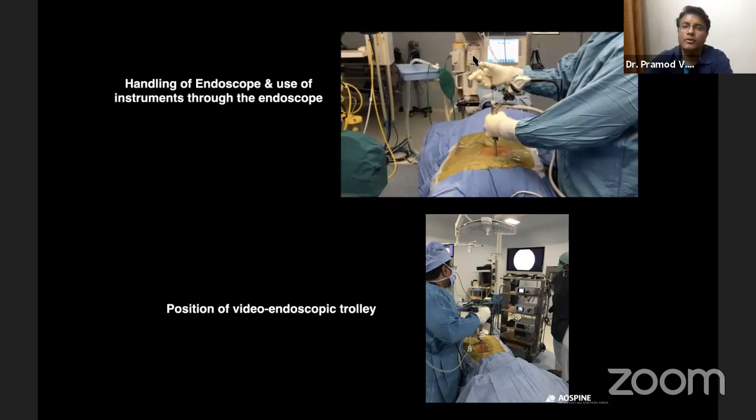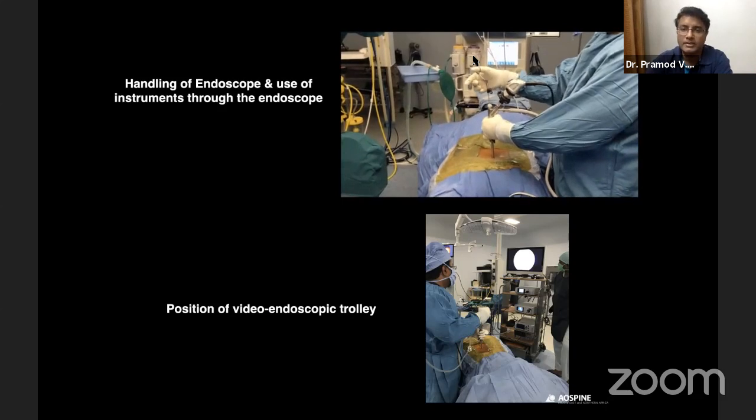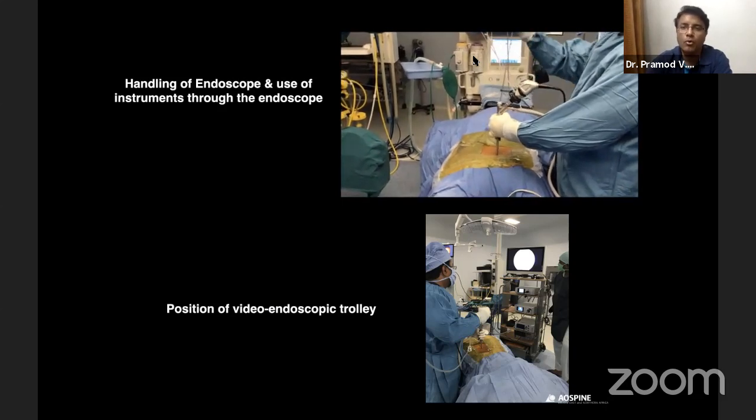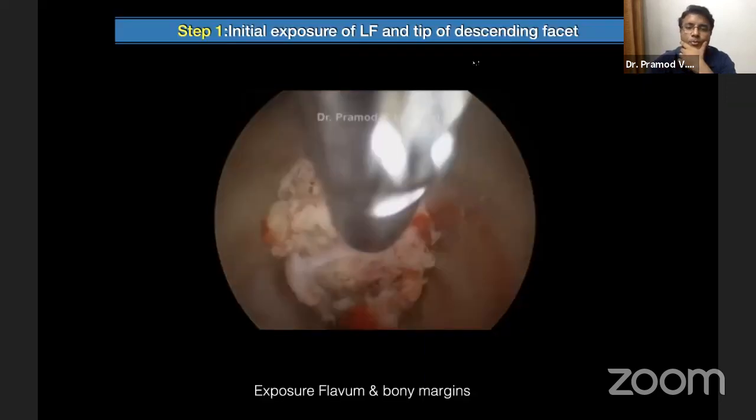Yeah, so it's a uniportal technique where the working channel lies inside the endoscope itself and only one single instrument can go through the endoscope at one time. And this is the position of the video endoscopic trolley.